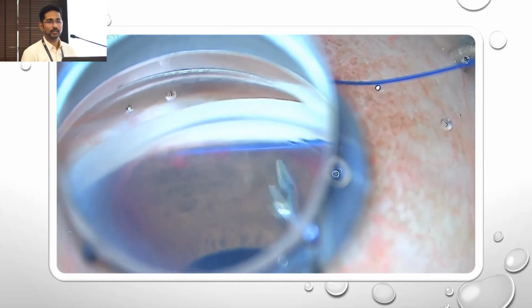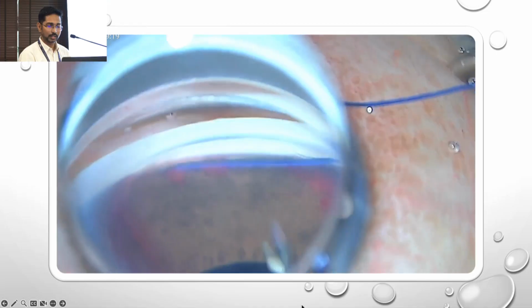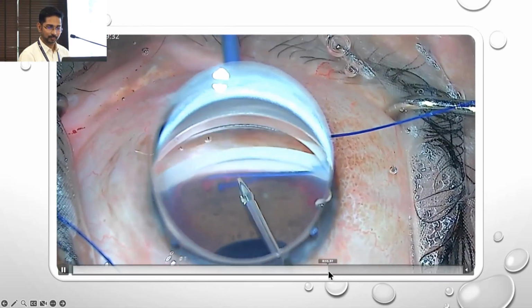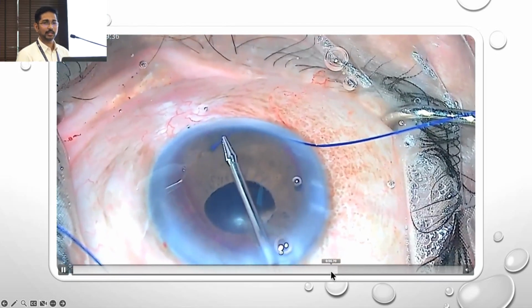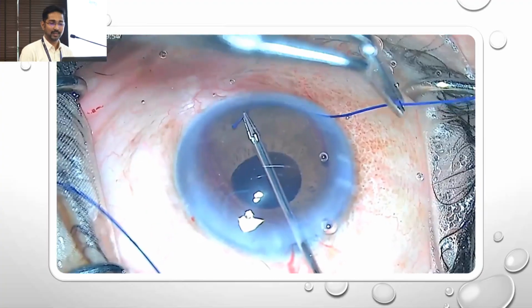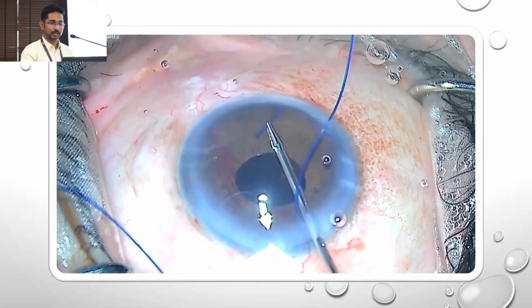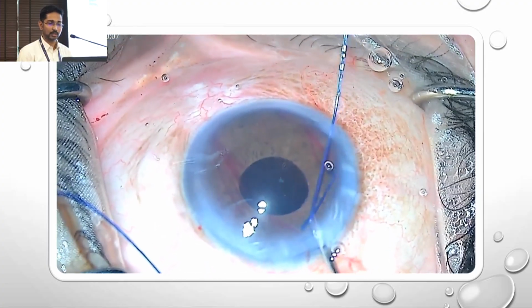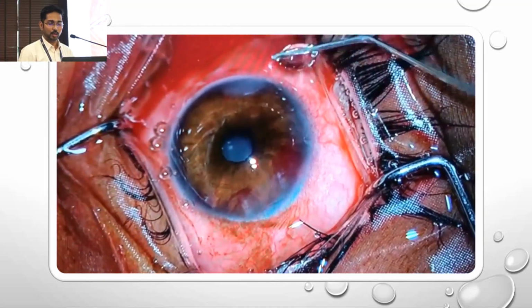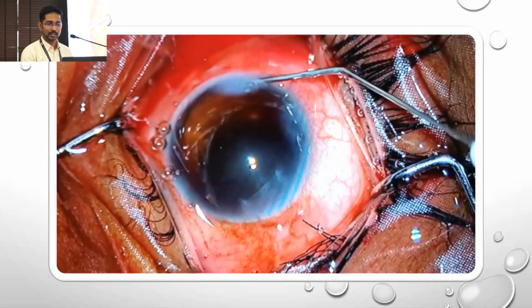It takes around 25 to 30 single passes for the suture to travel the whole 360 degrees and emerge out from the incision. And the first time that it emerges out, it's a wow time. You will have a goosebump feel. And then once it's out, you just have to pull it on the outside with a McPherson and on the inside with the Grishaber forceps, and achieve a 360-degree trabeculotomy. And this is an intra-op surety that your procedure has been really successful.